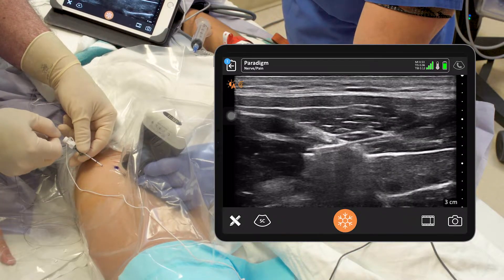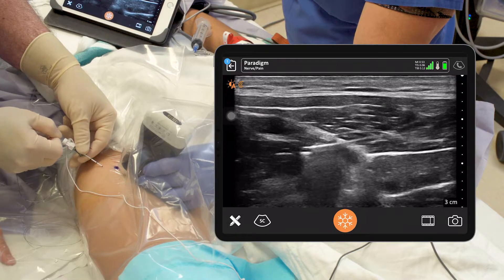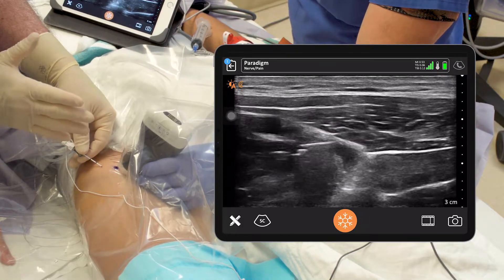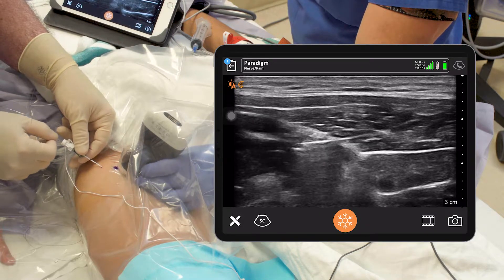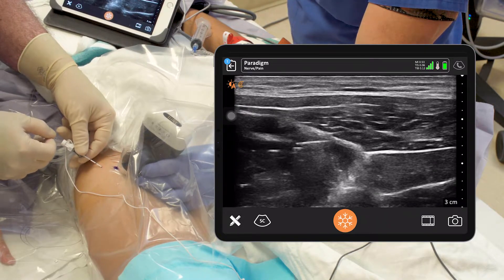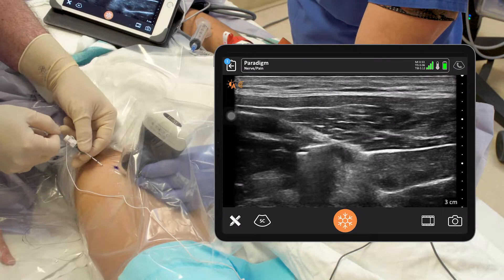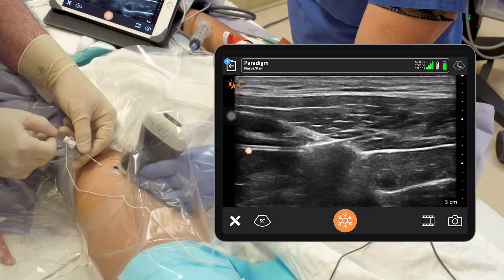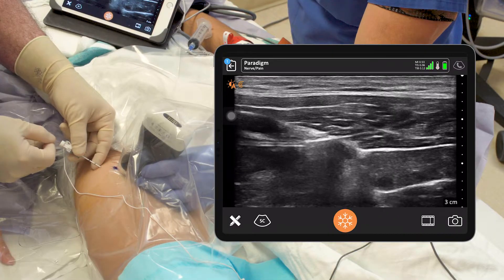We can see our needle really well to slide in our catheter. I've got the bevel turned down the leg towards the knee, so we want the catheter to come in and then slide along parallel to the artery and the nerve and go down three or four centimeters. We can see our catheter coming out right there, going down the leg.